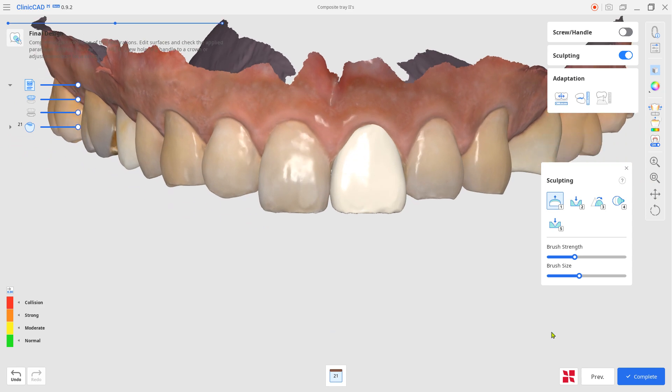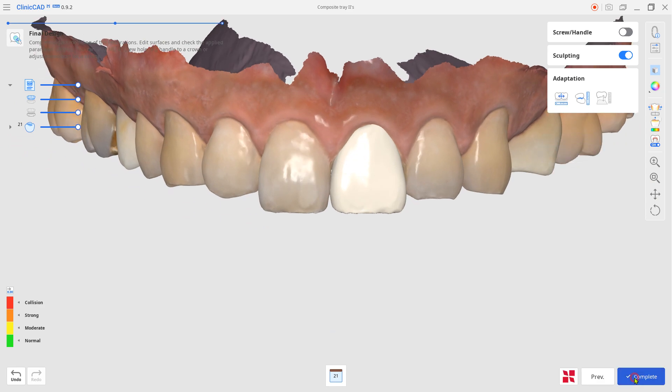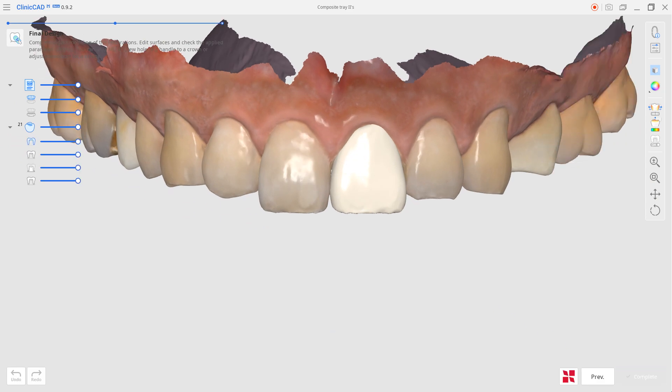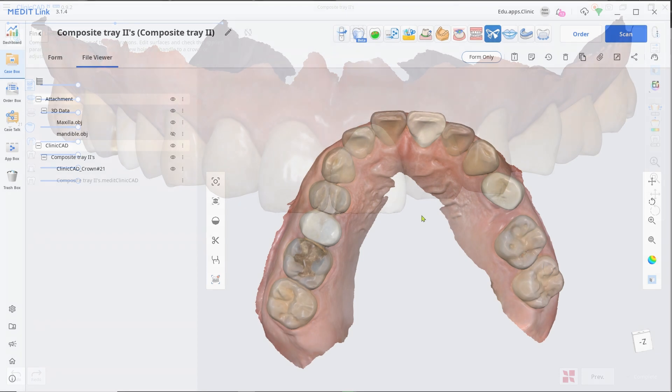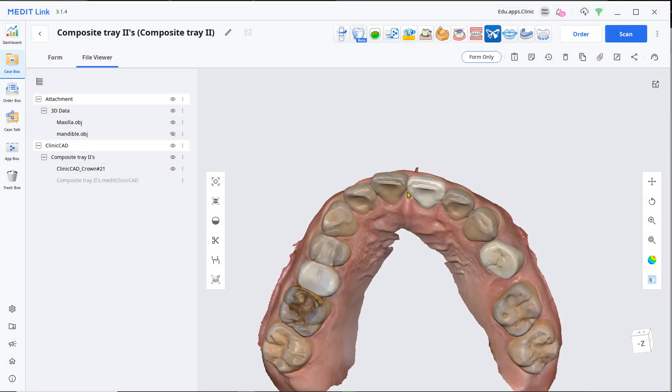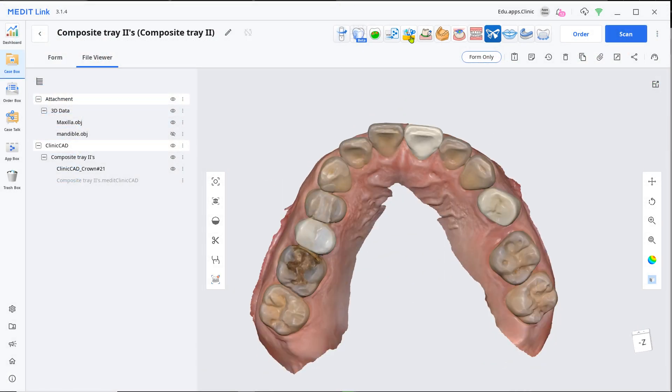Click Complete to save. Load the crown and maxilla from the design app.